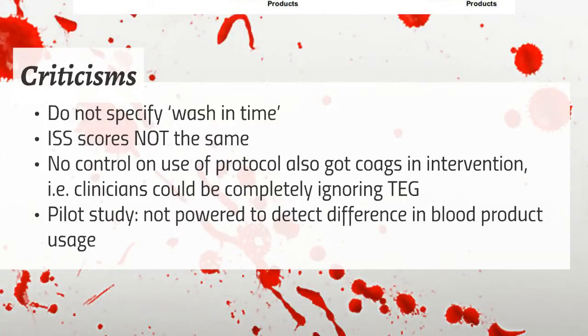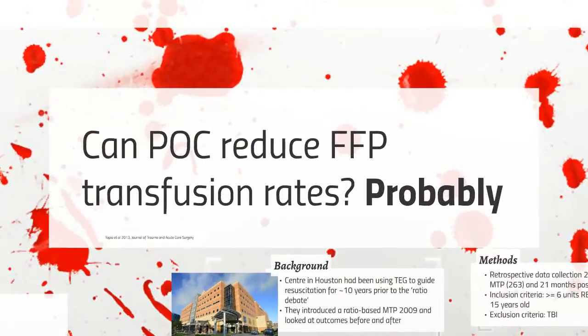It was just a feasibility study, really. It was a pilot study. It wasn't designed to look at, it wasn't powered to look at blood product usage, unfortunately. And the ISS score can explain the mortality difference.